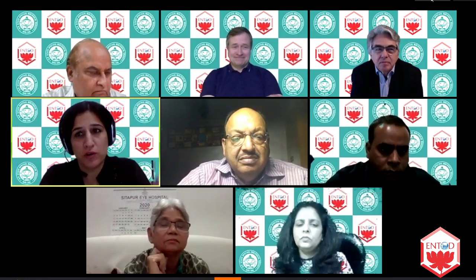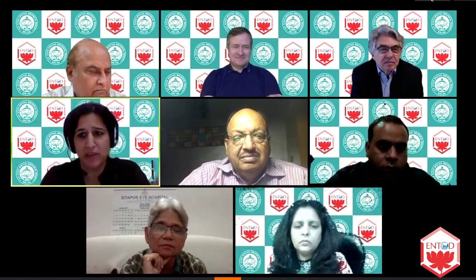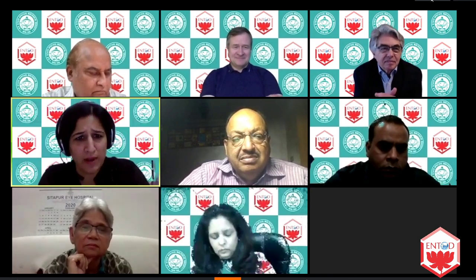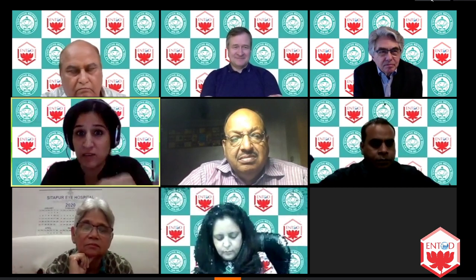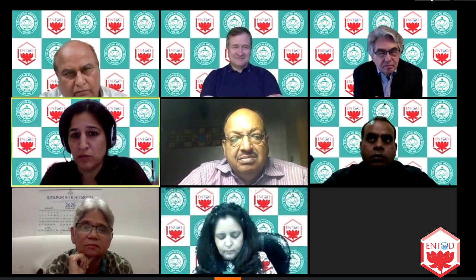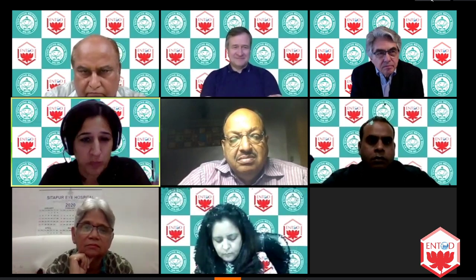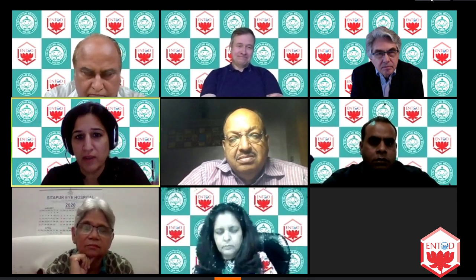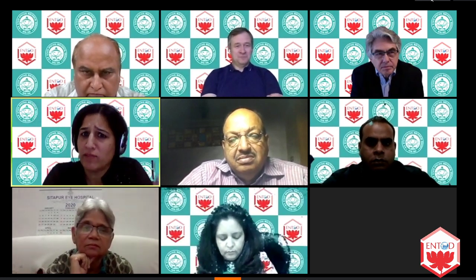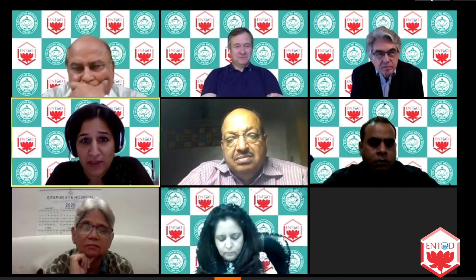I would go for manual capsulorhexis, as Dr. Kamaljeet sir has been saying, because it works well in our hands and most of us. And with femtorhexis, the problem of the tears is always there. The micro mini can opener sort of a thing is there. And the cost issue, of course, is very, very high. Only in those patients who have hypermature cataracts, there is this issue of the Argentinian flag sign.